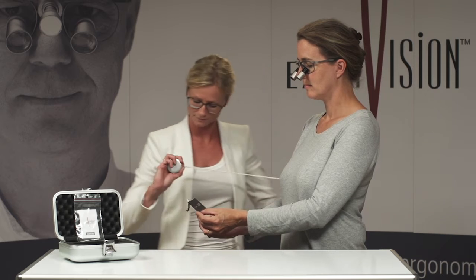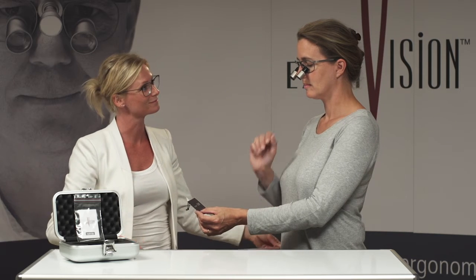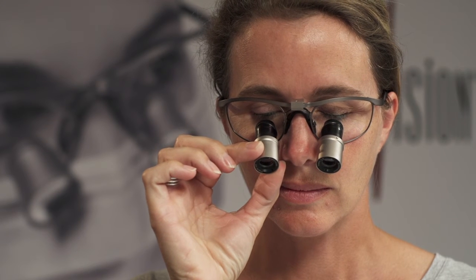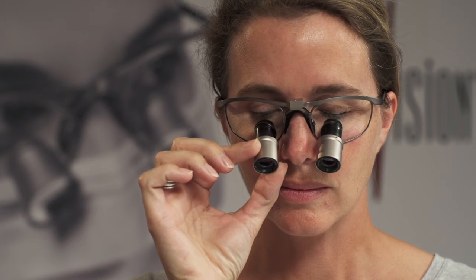Then close one eye so you're only looking through one telescope. Gently turn the metal part of the telescope until you achieve the sharpest image. Repeat for the other eye.